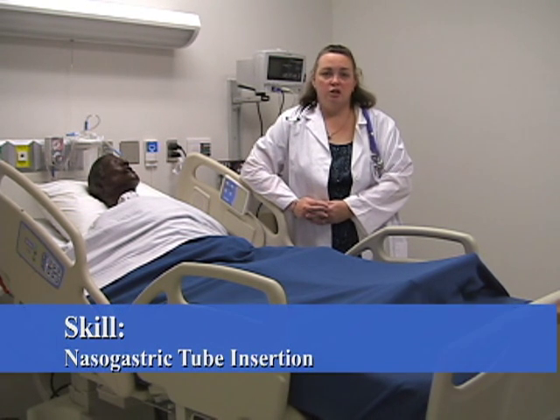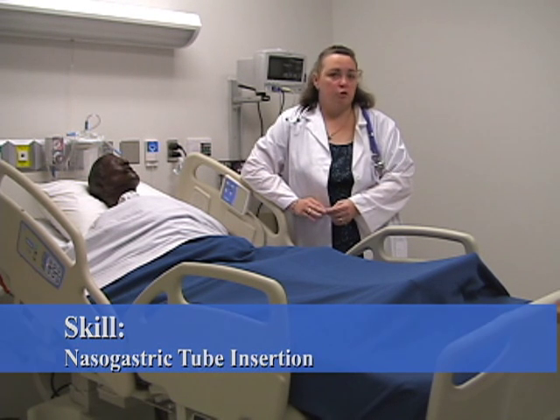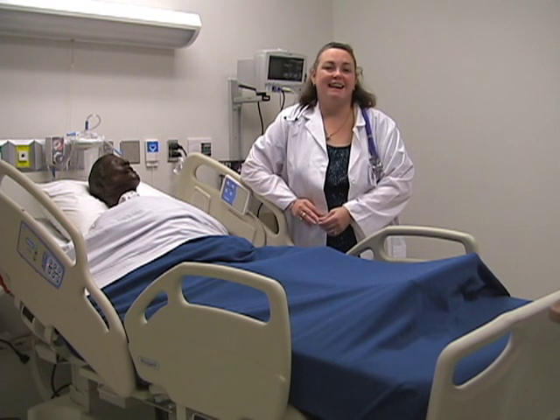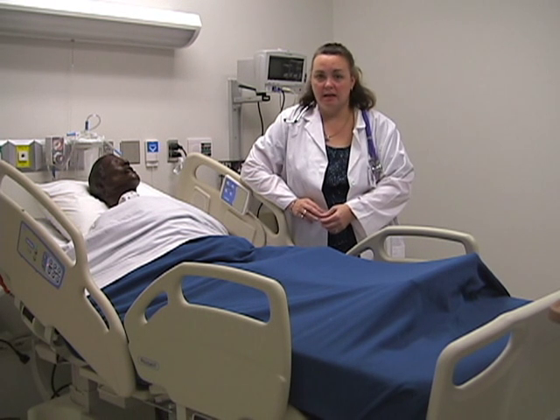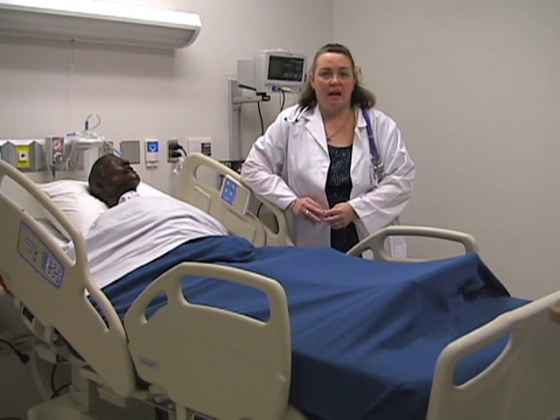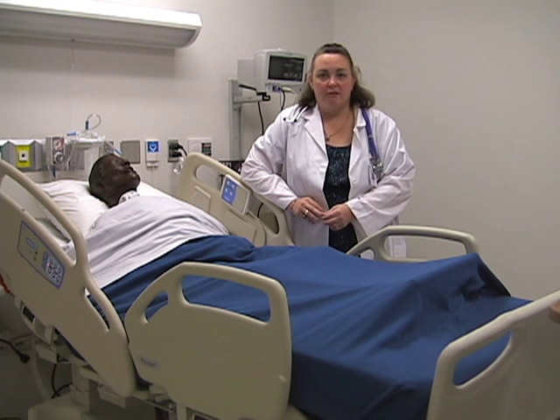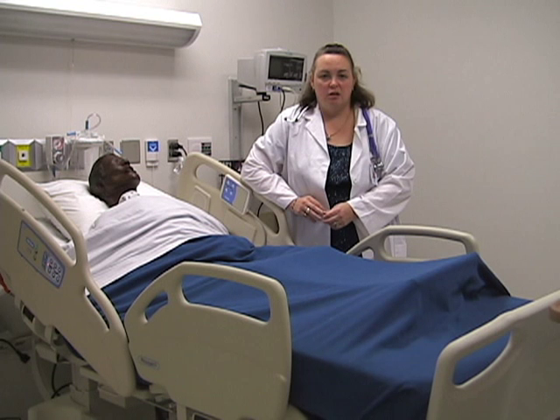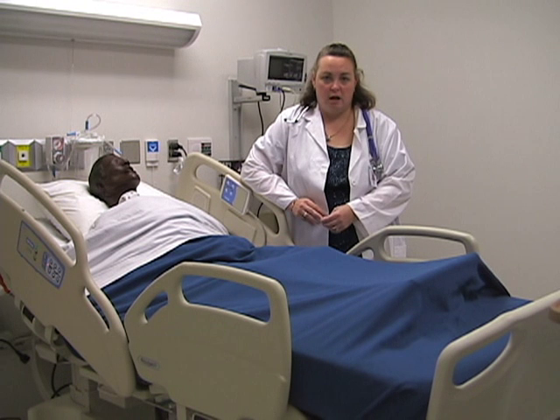My name is Diana Garza and I'm going to be demonstrating NG tube insertions. NG tubes are usually inserted for a couple of different reasons: one is for nutritional purposes, for the patient that cannot tolerate PO intake or is not taking in enough PO intake. We also use it for irrigation, for evacuation of stomach contents, and for relief of nausea and vomiting in patients who are having intractable nausea and vomiting issues post-operatively.